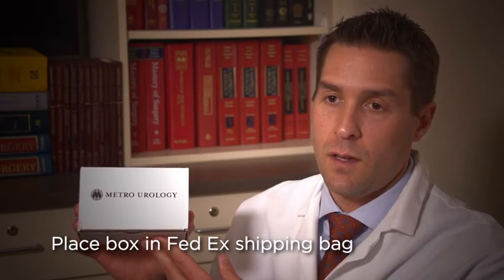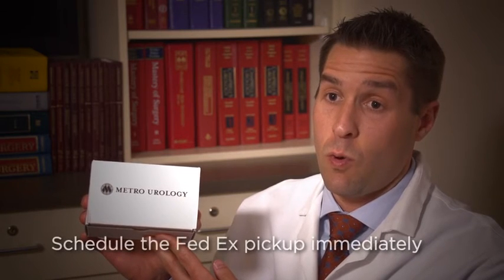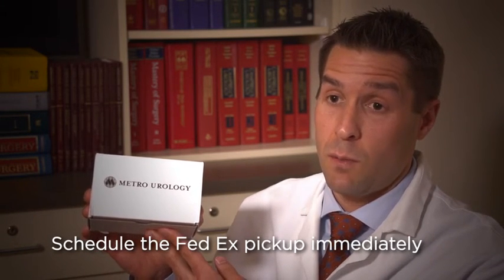Once the specimen cup has been placed inside the box, please place the box inside of the FedEx bag provided. Then apply the prepaid packaging label onto the bag and call 1-800-GO-FedEx to schedule a courier pickup. It is very important that you schedule this pickup immediately after the collection has been prepared.